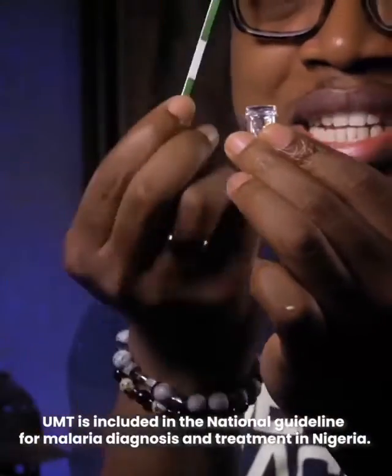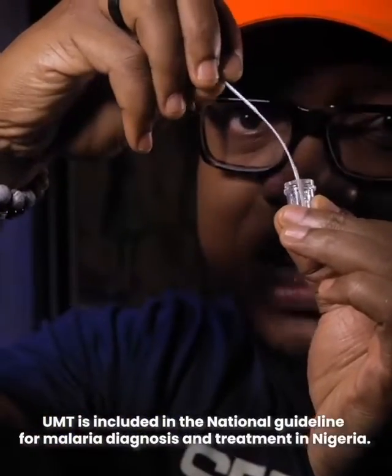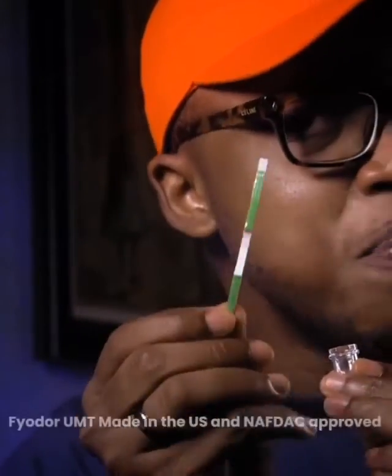You will see another small container that they added. Add your urine inside, then place the part of the strip that has arrows into the urine. Wait for 25 minutes. After 25 minutes, if you see two lines, it means you have malaria. If you see one line, it means malaria may not be the problem. If you see no lines, then you might have to repeat the test.